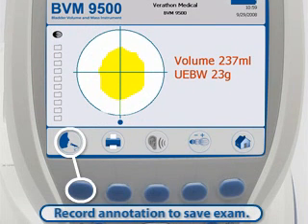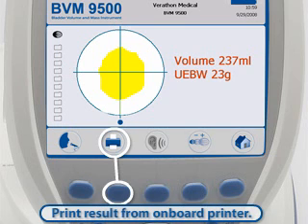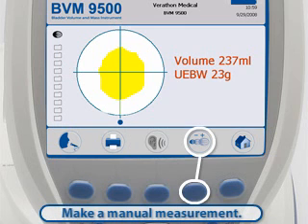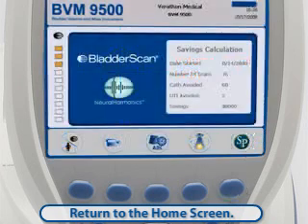Record a voice annotation to save your exam. Please note that if you do not voice annotate the current exam, the exam data will not be saved. Print the exam result from the onboard printer. Make a manual measurement of bladder wall thickness. For more information on this feature, please see the BVM9500 Quick Reference Card or User's Manual. Return to the home screen and perform another exam.